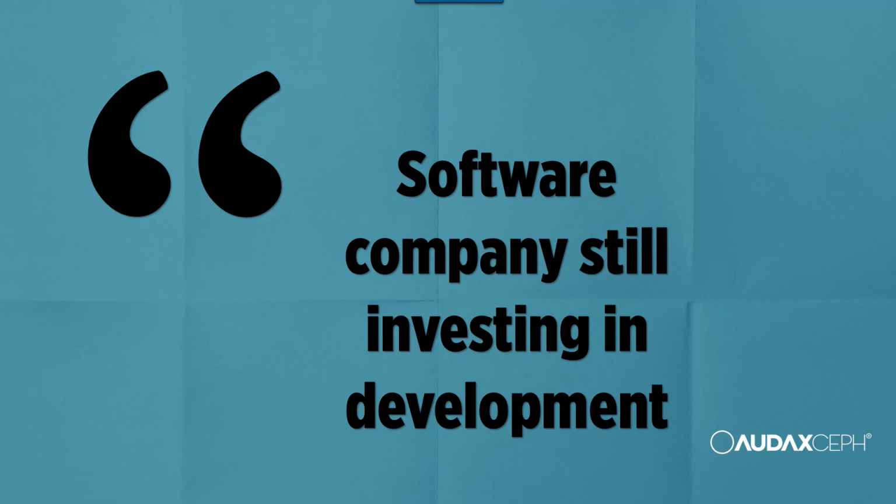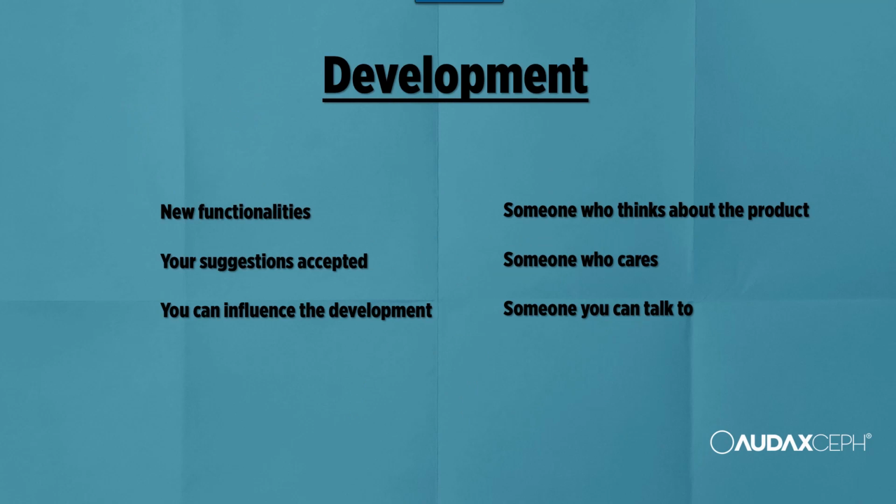Be sure that software is being developed. Be sure that software companies are investing money from sales back into the software product. They must live, they must give you service because they are your service. They should not be at the edge of extinction. This assures you that there will be new functionalities available, such as automatic tracing, quick support, issues solved, your suggestions accepted in future releases.